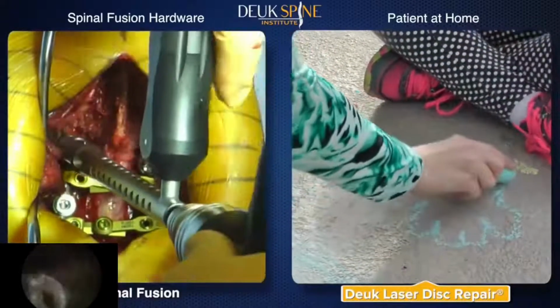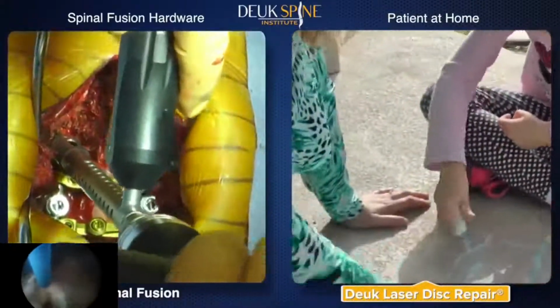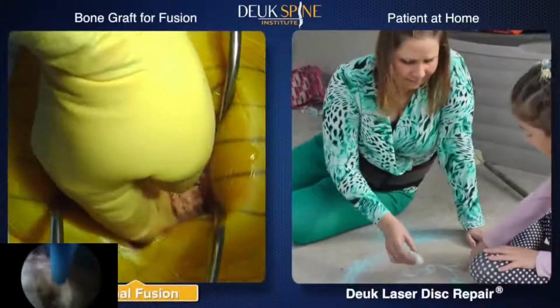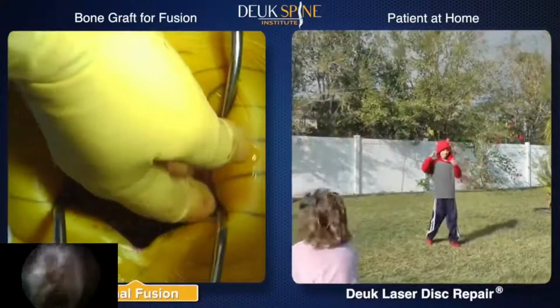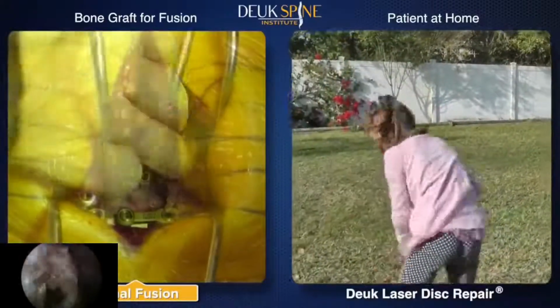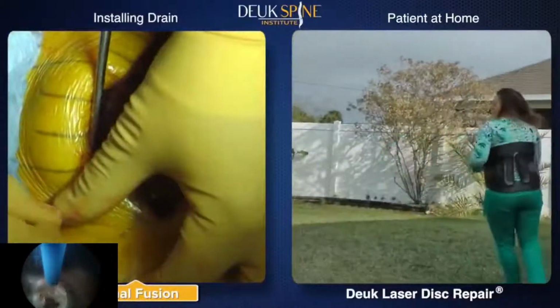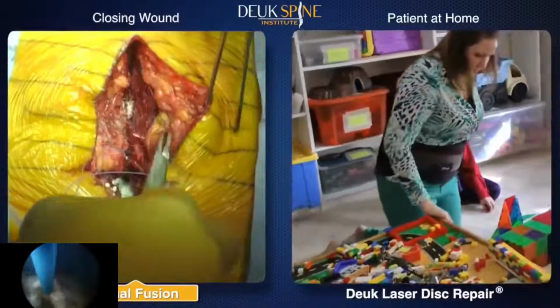The Deuk laser disc repair patient is soon back home, enjoying life, with a very fast recovery, allowing normal activities without pain. Meanwhile, bone graft material is placed throughout the fusion surgery site. These morselized pieces of bone will eventually grow together to help promote the fusion process. Prior to closing the wound, a temporary drain is installed to allow excess fluid to drain.